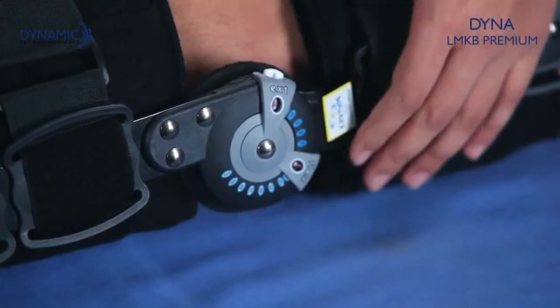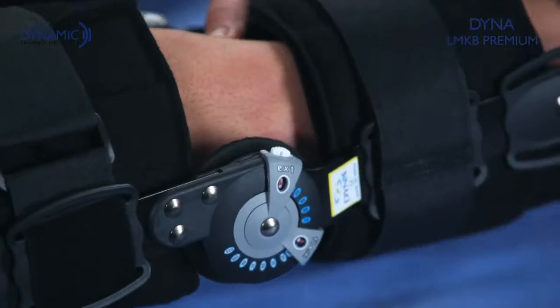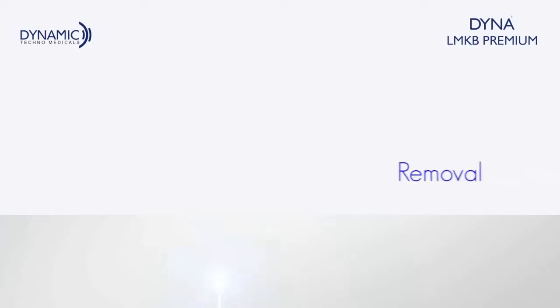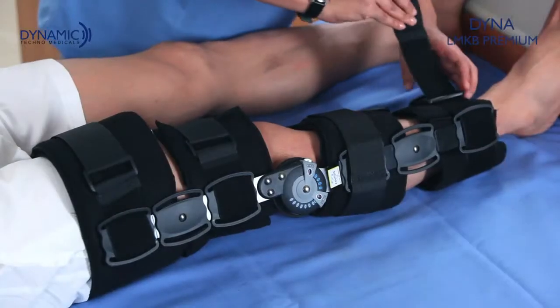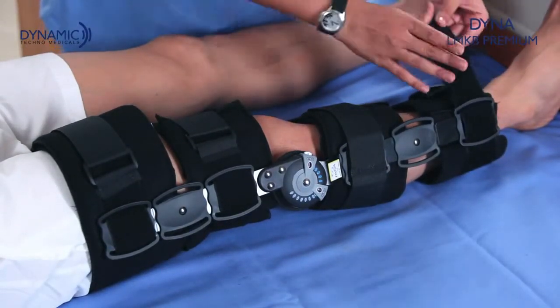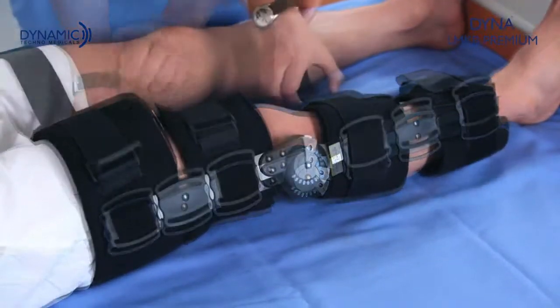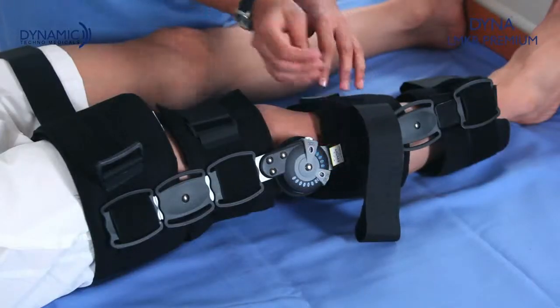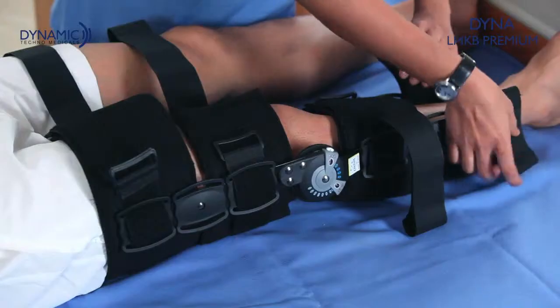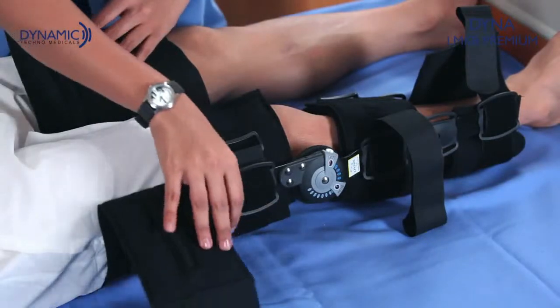Remember: for complete immobilization, set the flexion and extension buttons at zero-degree angle. Unfasten the straps and bands in reverse order of fastening — that is, the lower calf, then upper thigh, then upper calf, and lastly the lower thigh. Remove the brace from the leg by gently slipping it off sideways.